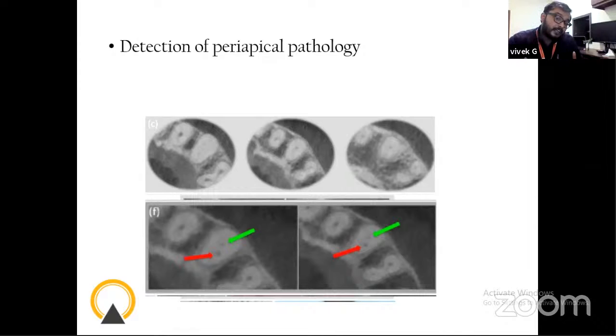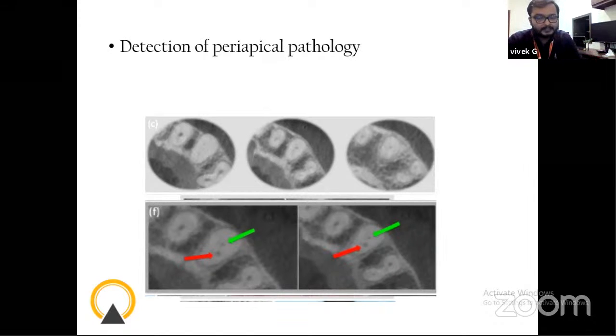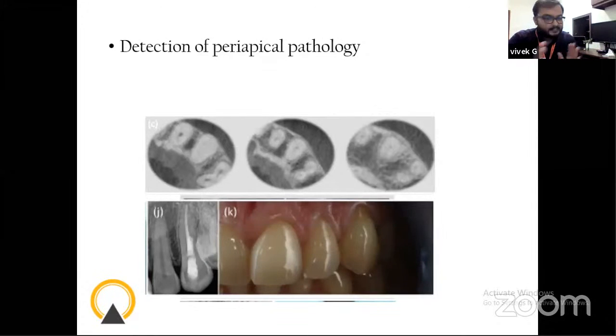So they went in for an intra-operative CBCT scan. And that's what I'm saying, CBCT scan always pre-operative, if needed intra-operative. With the second CBCT scan, they could see that they were going in a wrong direction, and with its help they could adjust their path, get to the pulp chamber and do a proper endodontic treatment.